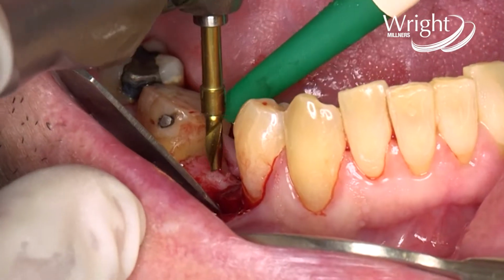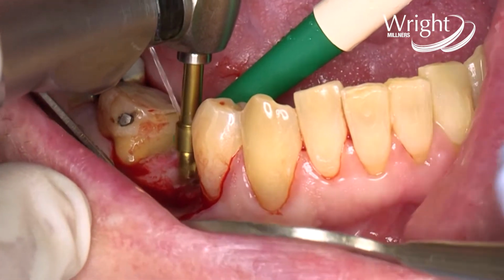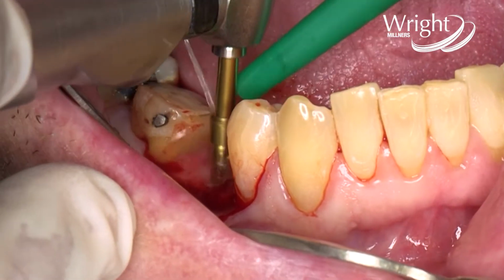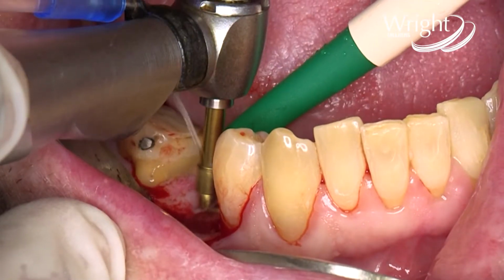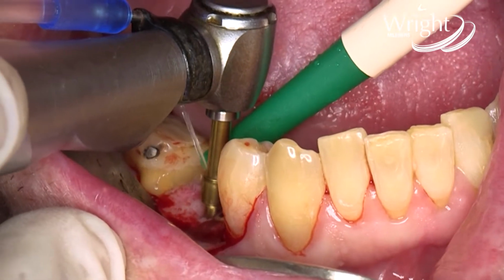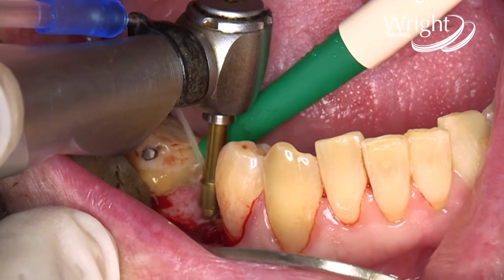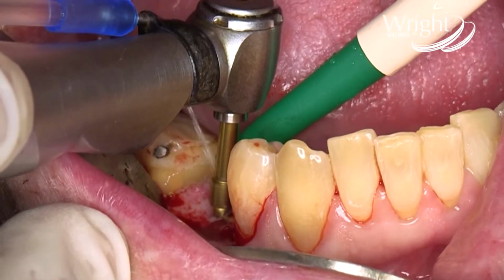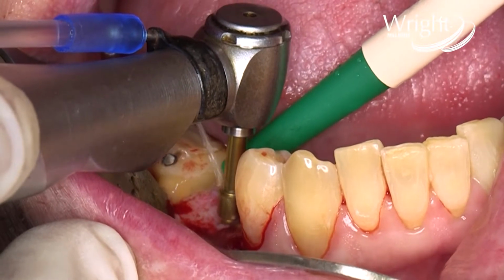When we start drilling, we will go in with a pump action, and that is so we clear the bone that's coming off there, and we're not generating too much heat. So in a pump action, we go up and down till we get to the depth of the drill. Now I have determined beforehand from my cone beam and my periapical planning what the length of implant will be. So I can go up and down till I get to the depth.